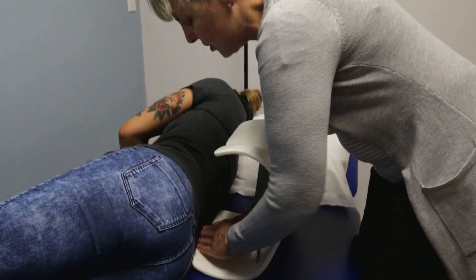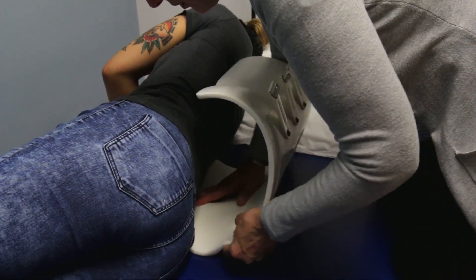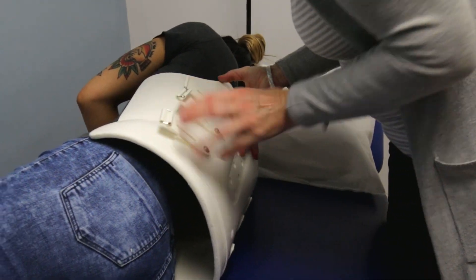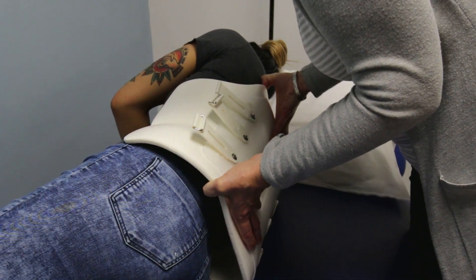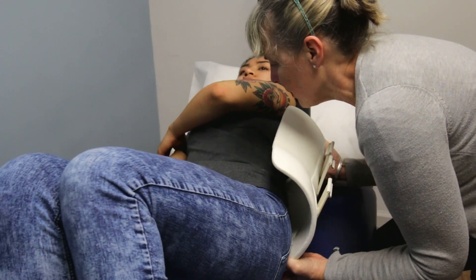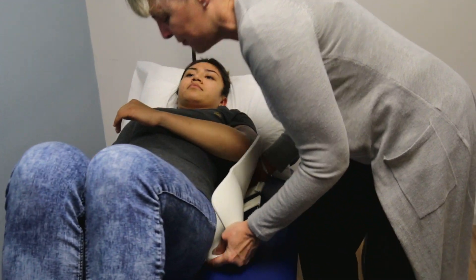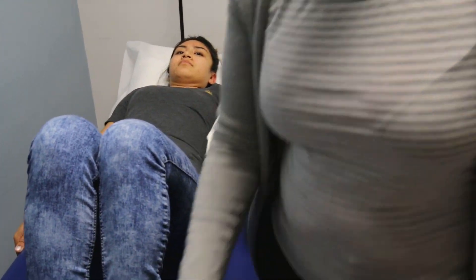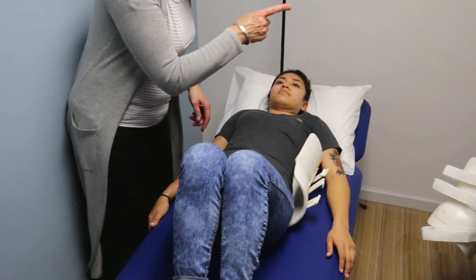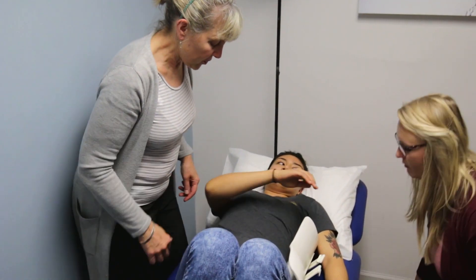The easiest way to do that is to try and flatten the brace, bring it around, and as they roll we're going to push it under, then get them to roll flat back. It's not uncommon for the brace to start to slide out, so sometimes you have to do a second roll towards the other side.